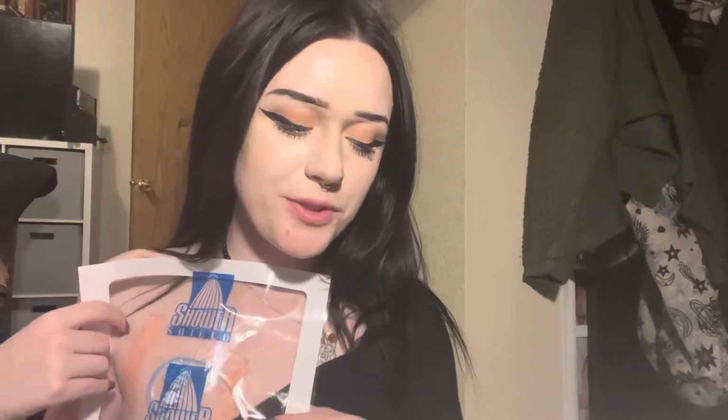I'm still going to do what I normally do with the gauze and then the Tegaderm, then put this over it, shower normally and see how well it protects. My current system is I drape my head over and I have an extender on my shower hose. I wash my hair first, then put it up in a shower cap and do the rest of my hygiene, so I don't shower like a normal person anymore. Gosh, I miss showering like crazy.